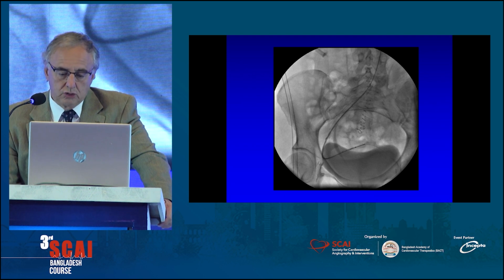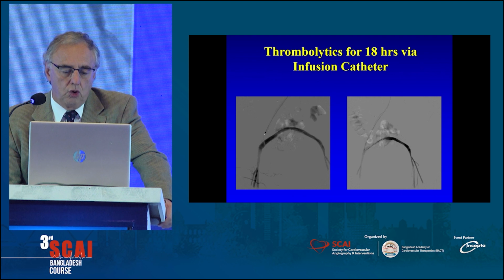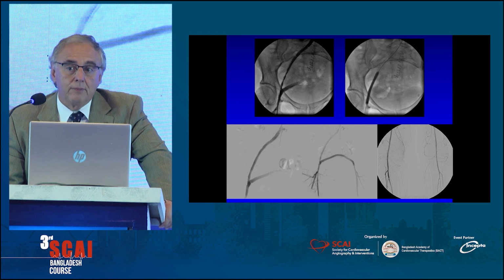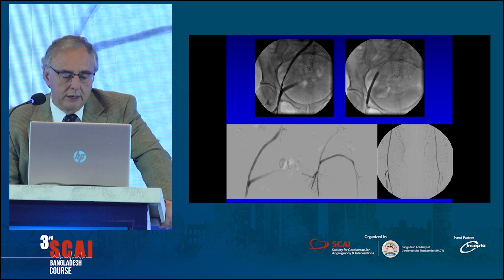I brought the patient back the following day, and you see now that the bypass is open and filling. If you notice up here, this is the stent where the patient probably had an acute occlusion, and we have some residual disease here that I treated with a balloon and another stent. And you see here now we have a wide open right iliac that goes down the same leg, and then through the bypass goes to the other leg, and we have distal flow, SFA, popliteal, and three-vessel runoff.